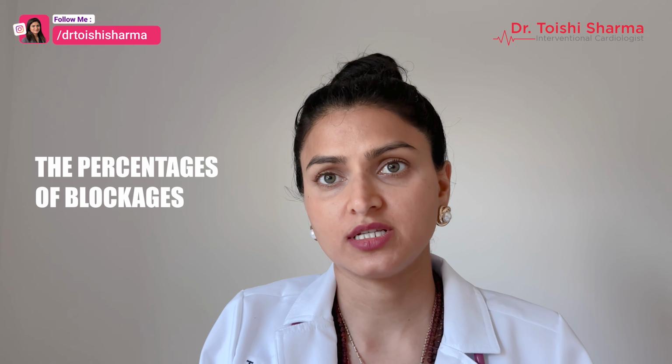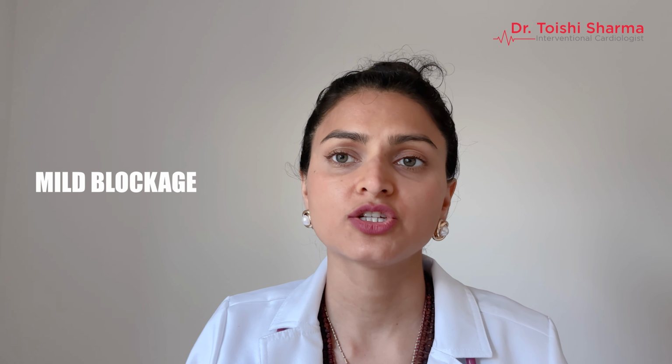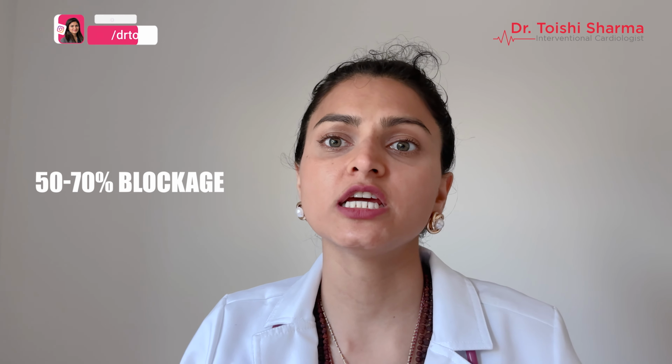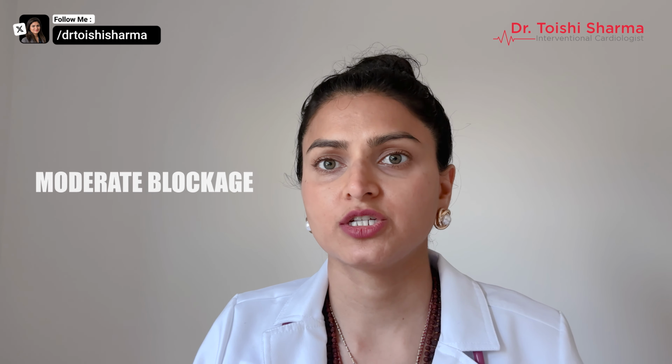Now let's understand the percentage of blockages. Here's how to interpret the numbers. If it says less than 50% blockage, this is a mild blockage which is usually treated with medications like aspirin, statin, and lifestyle changes, which include diet changes and exercise regimen. If it mentions 50 to 70% blockage, this is a moderate blockage.